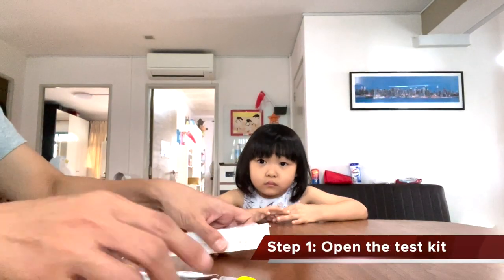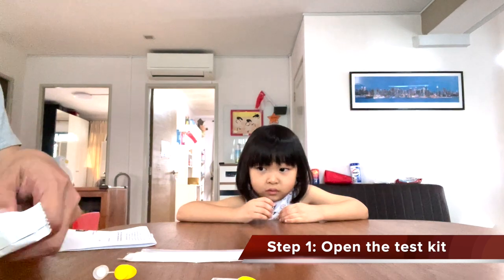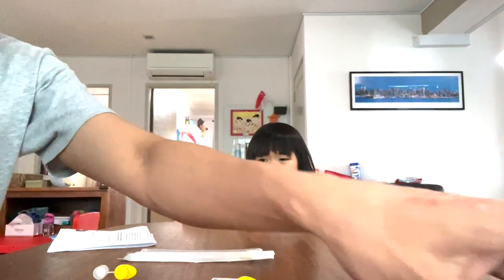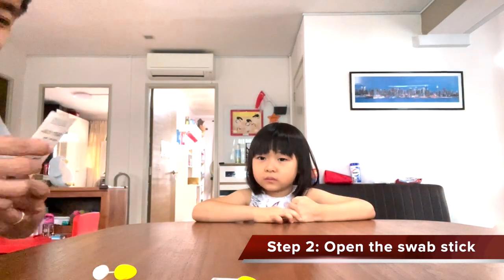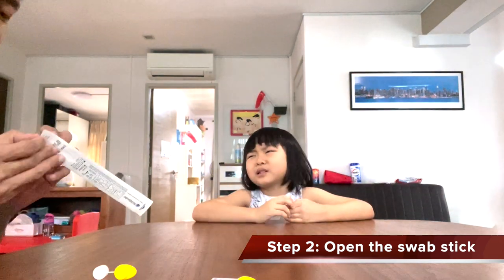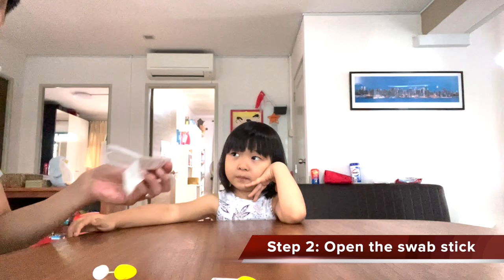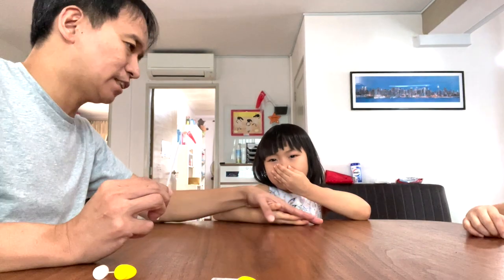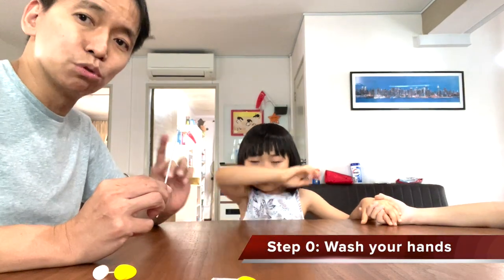The first step is to open up the test kit — the cartridge — and this is where you will be dripping the fluid, and you will be leaving this test kit for 15 minutes. The next step is to take one swab stick that looks like this, and this is what you will be putting into your nose. Each nose, you will put it in and twirl it five times, sometimes leaving it inside for five seconds. You have to put it deep in at 2.5 cm. Step one, actually, is to wash your hands.